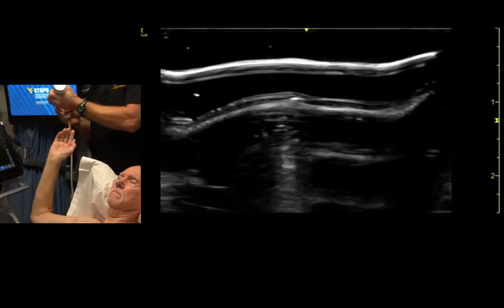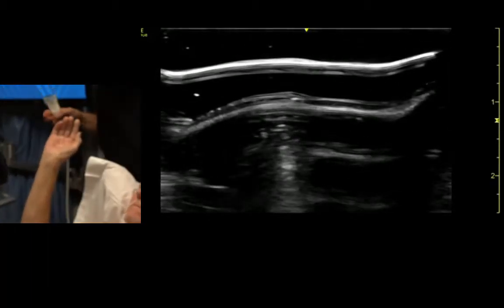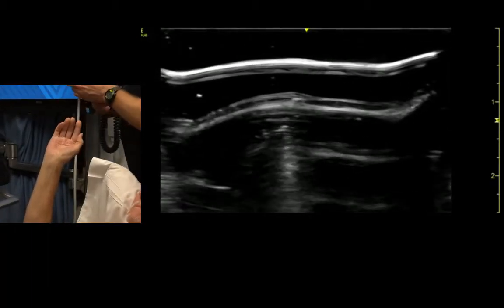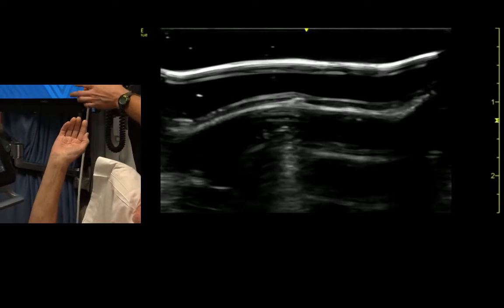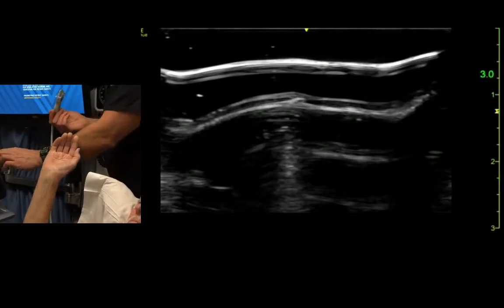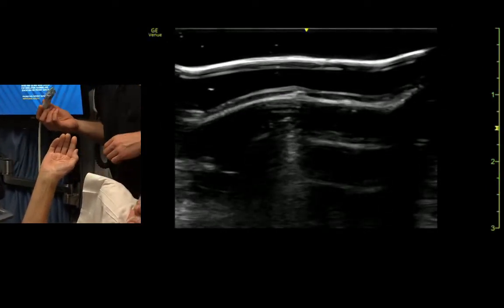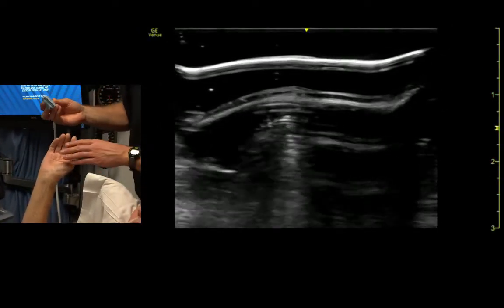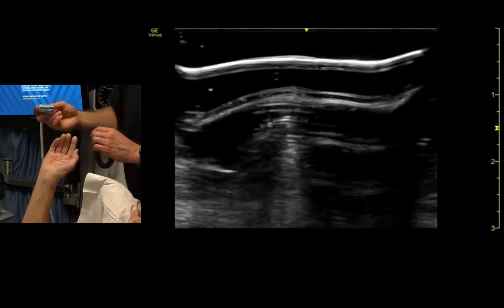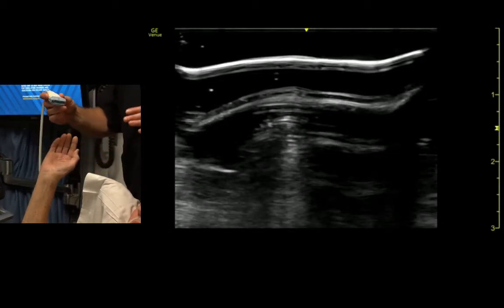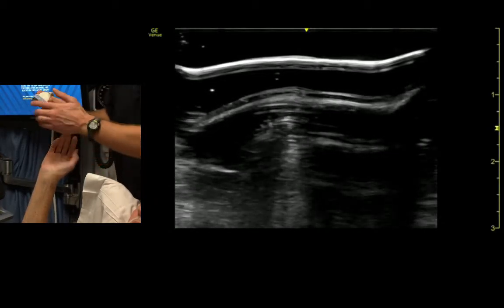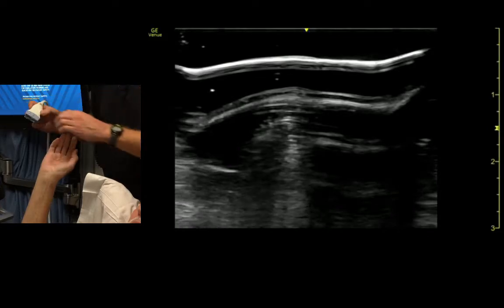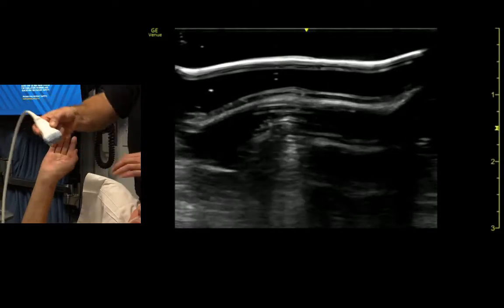We're going to check out the structures in the axilla. Since I'm behind the patient, I'm going to keep the indicator away from me, because it's more away from me on the screen where I'm looking.